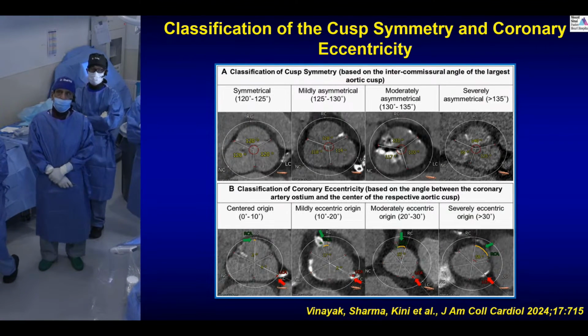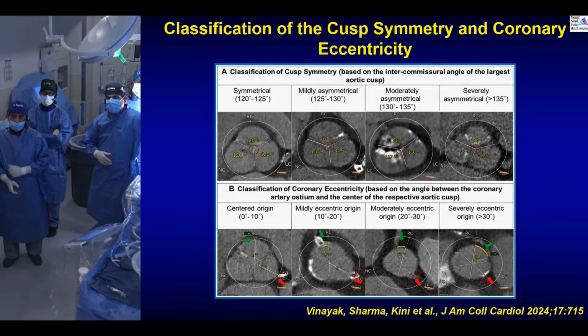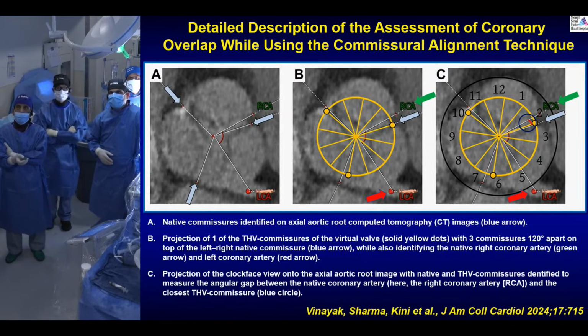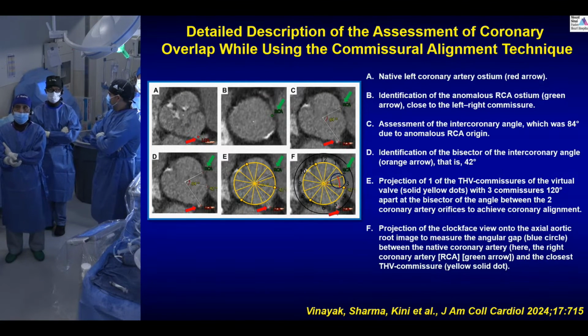Yeah, I think this is a very important point, because we have always spoken about commissure alignment. Yes, God has made commissures a certain way, but the arteries might take off in a different fashion. So commissure and coronary alignment are absolutely two different concepts. Should we aim more for coronary alignment? Should we aim more for commissure alignment? I think the jury is still divided. Gilbert introduced the concept of commissure alignment, but he feels pretty good about coronary alignment as well, and let's see what he thinks.